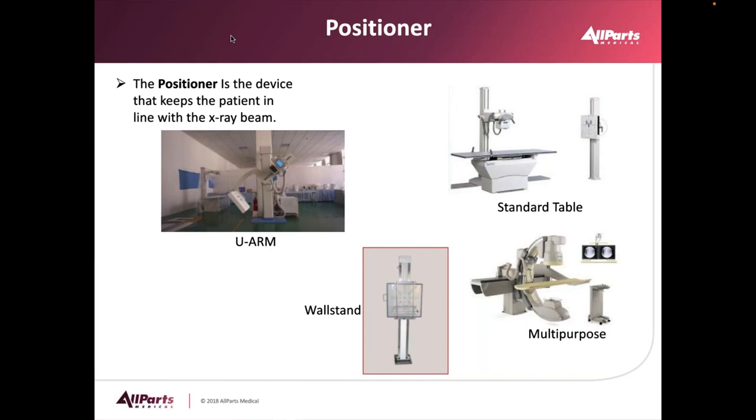We could have a multi-purpose table, which can be used for multiple different procedures. And then there's the wall stand, which is used to do chest X-rays.